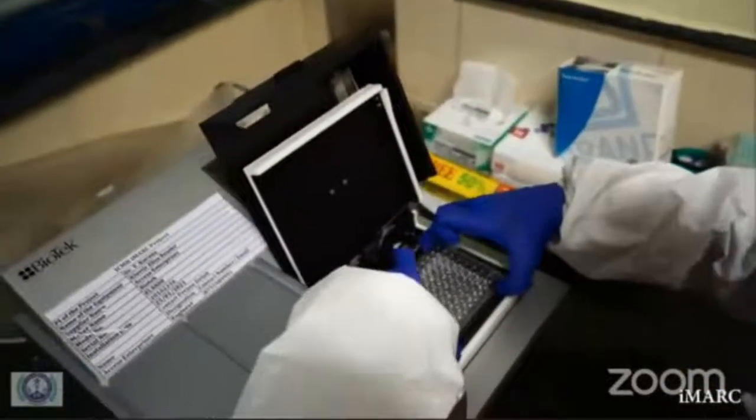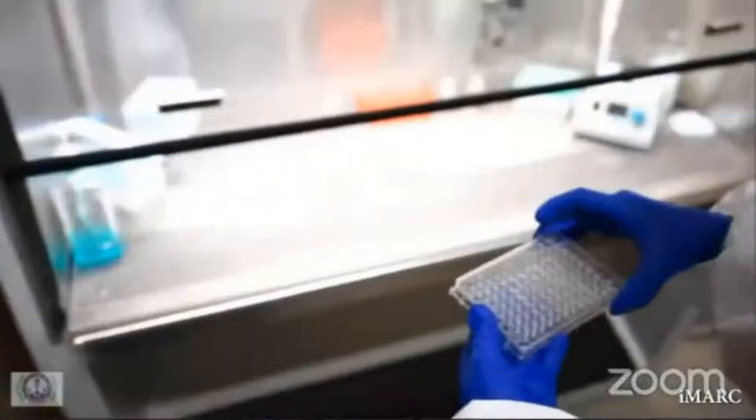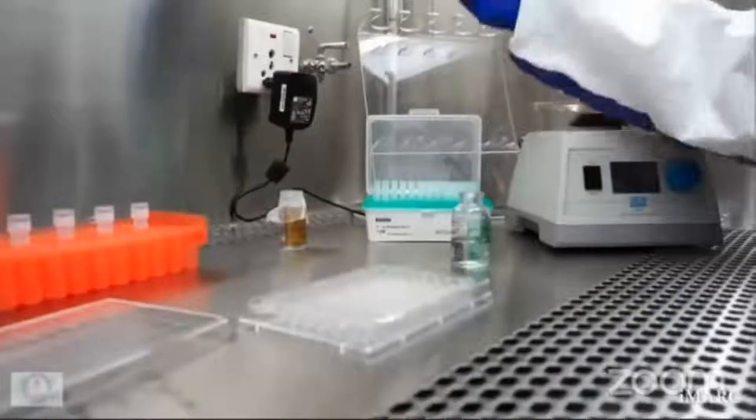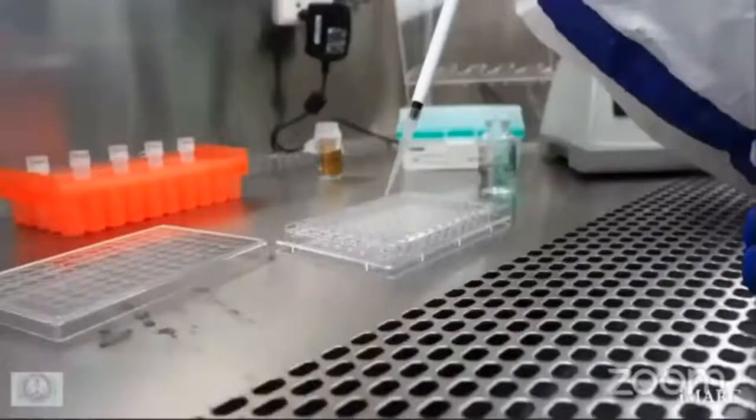Step number 4 is addition of standards. Add 25 microliters of glucan standards vertically from lower to higher dilution.